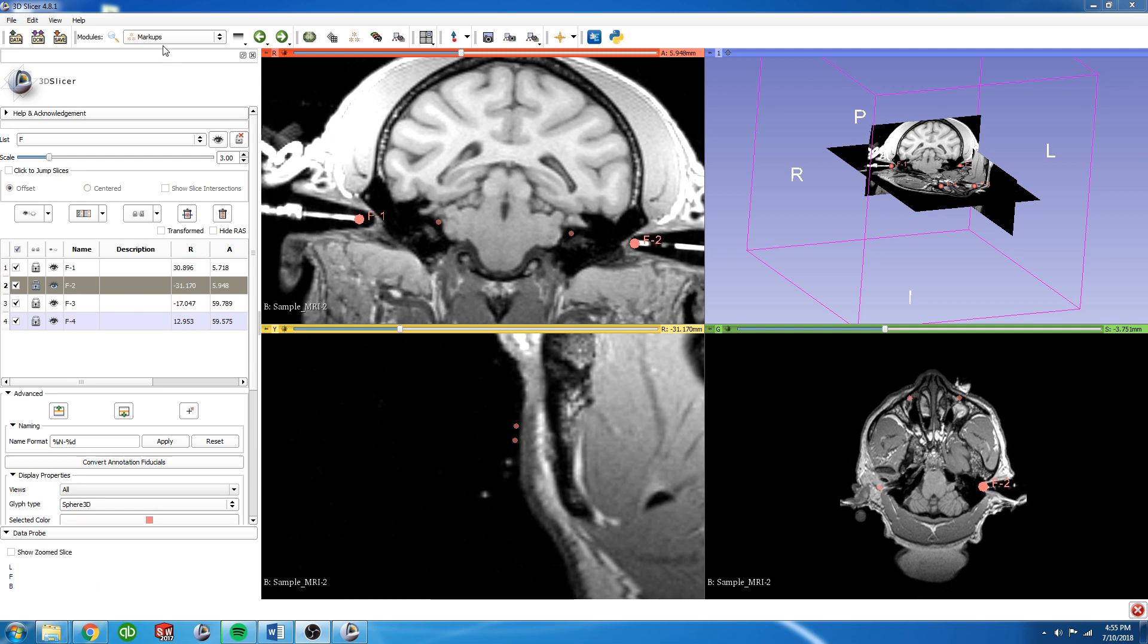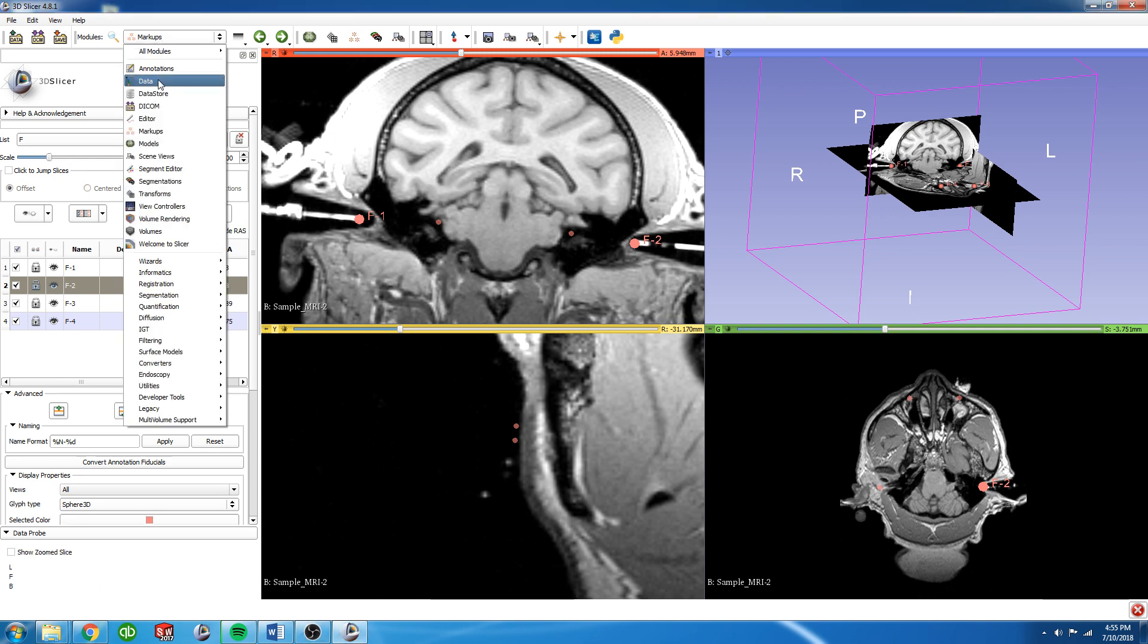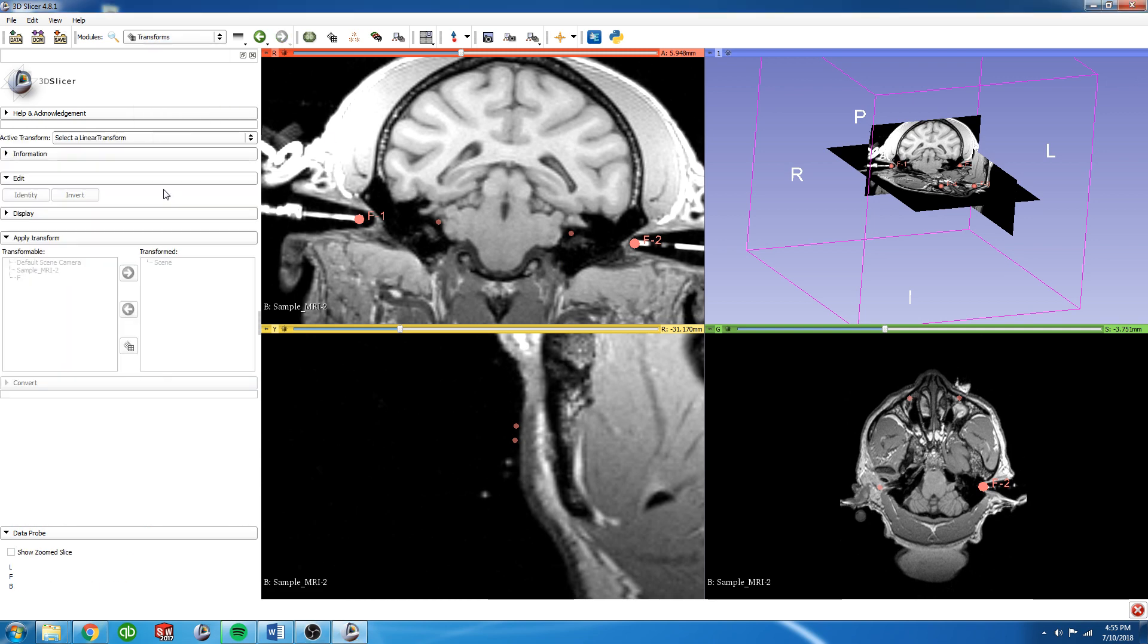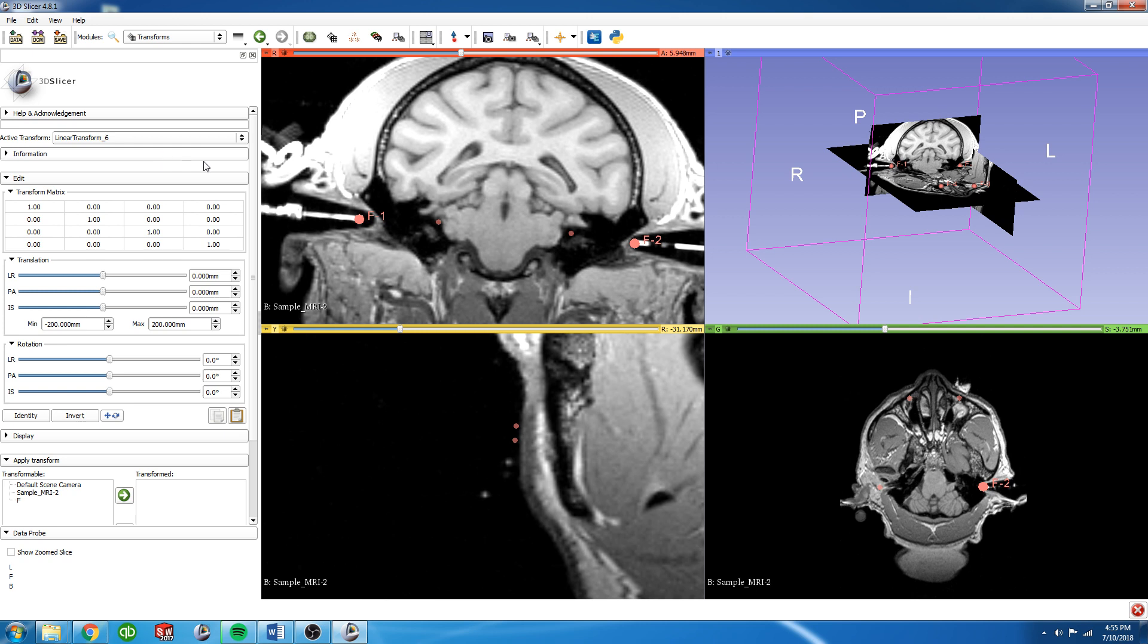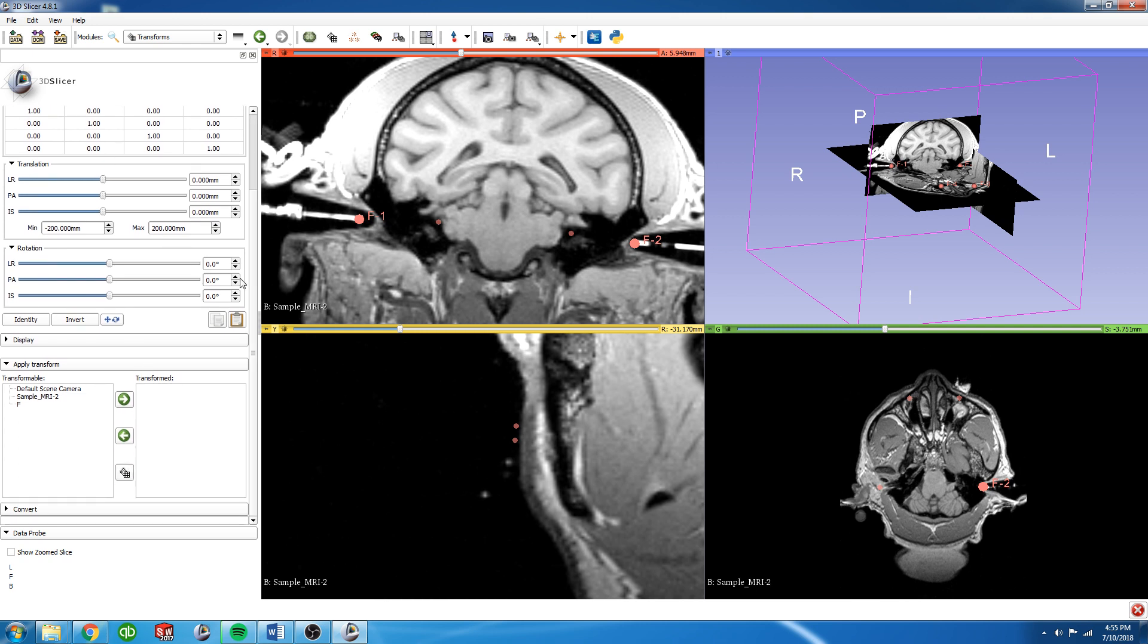To do that we're going to go into the transforms module. We're going to create a new transform and place the MRI into the transform box as well as the fiducial list we just created so that they move together.